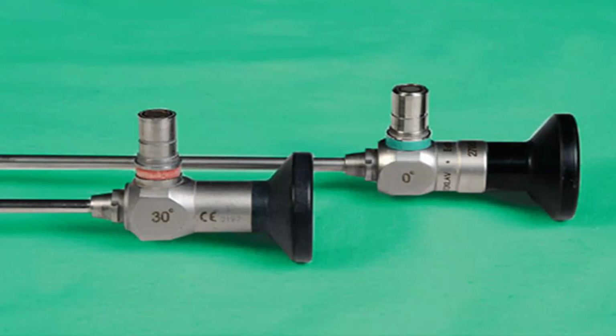Where is 0 degree used? Where is 30-degree used? Then you tell all the different procedures. Not directly clot evacuation or DJ stenting. Any instrument has to go in that order. If you don't remember this order, then every time we are not going to tell you: what is the instrument, what is it made out of, what are the characteristics of the instrument, how is it sterilized, how is it assembled, what are the different parts of the instrument, and then uses and limitations. Agreed.